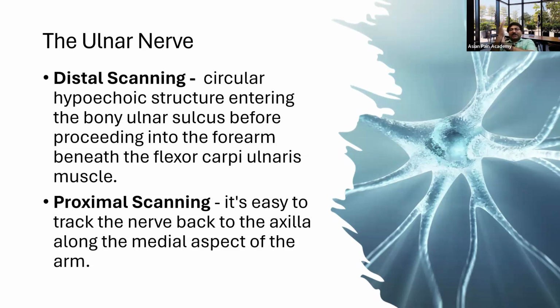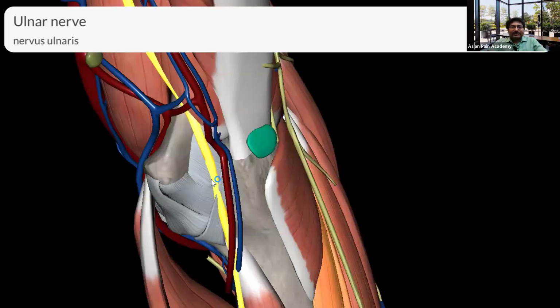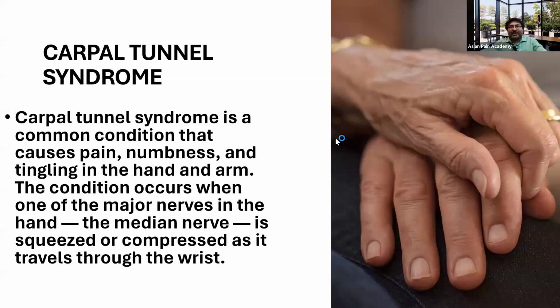Very simple. Carpal tunnel, and this is cubital tunnel syndrome. Okay. So here also it might get compressed, leading to cubital tunnel syndrome. To find this nerve is very easy. In fact, sometimes there is accidental injury and you will get some sensation here as well. So you have to get it in between these two structures. And sometimes there is a fascia covering it, known as the Osborne's fascia. And if there is contraction of this Osborne's fascia, this nerve will get compressed.